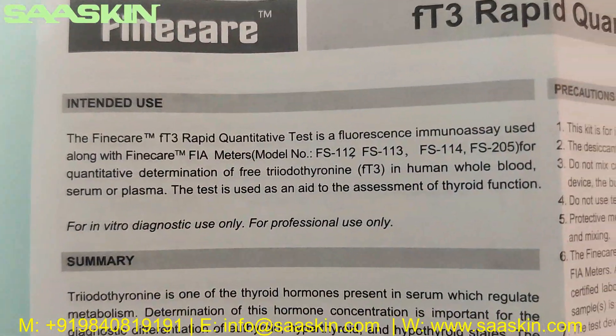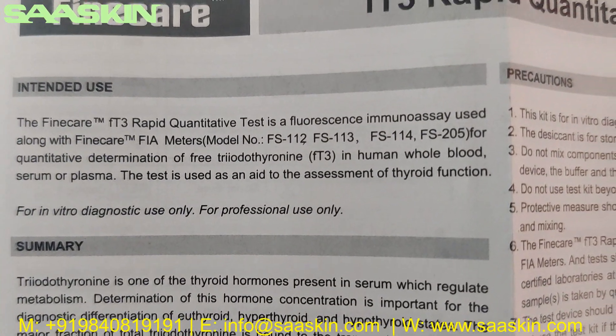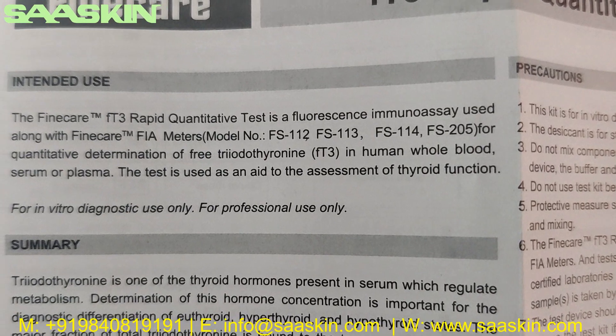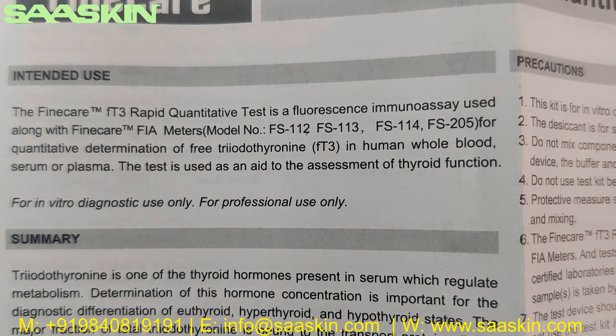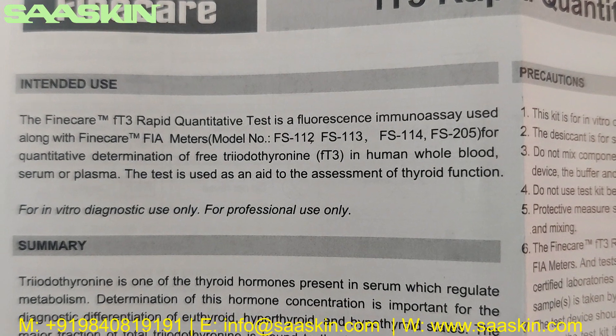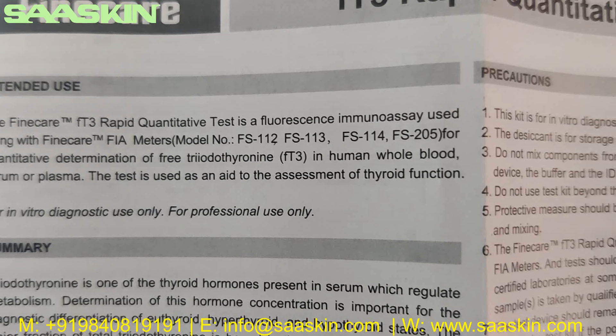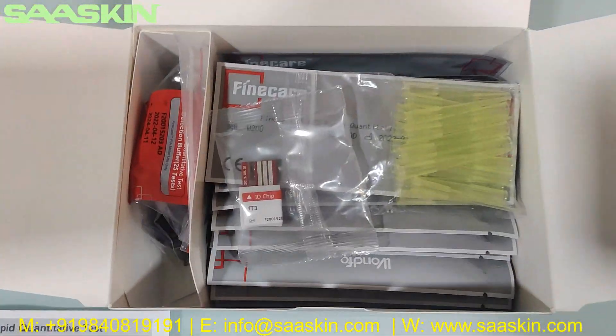Fine Care FT3 Rapid Quantitative Test — the Fine Care FT3 Rapid Quantitative Test is a fluoroimmunoassay used along with the Fine Care FIA meter for quantitative determination of free triiodothyronine (FT3) in human whole blood, serum, or plasma. This test is used as an aid in the assessment of thyroid function.